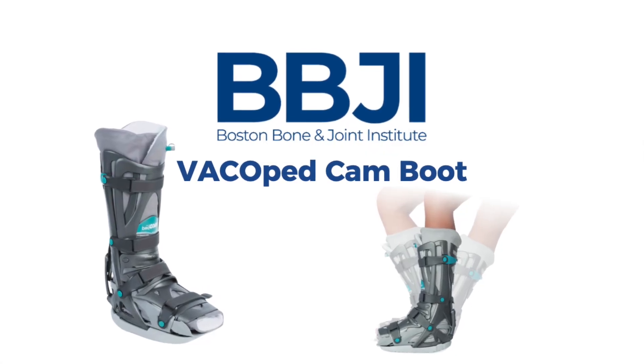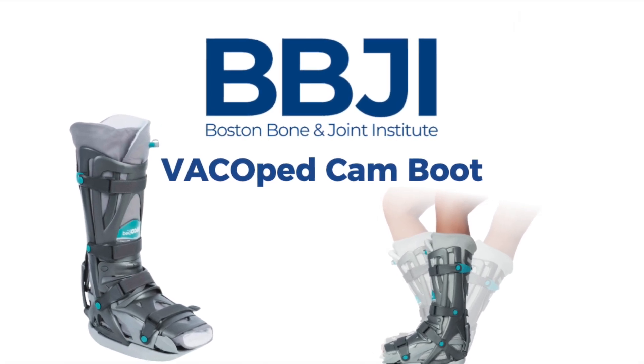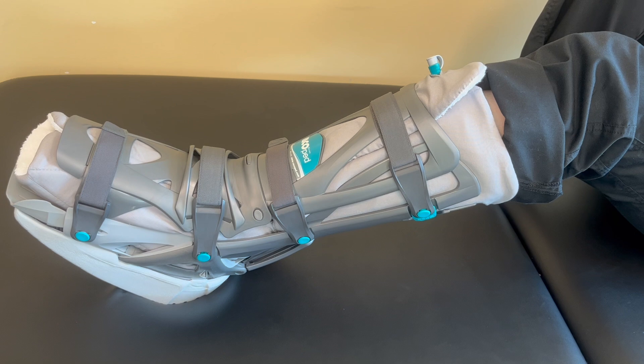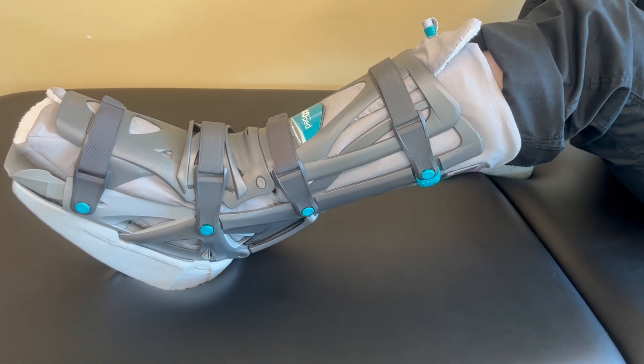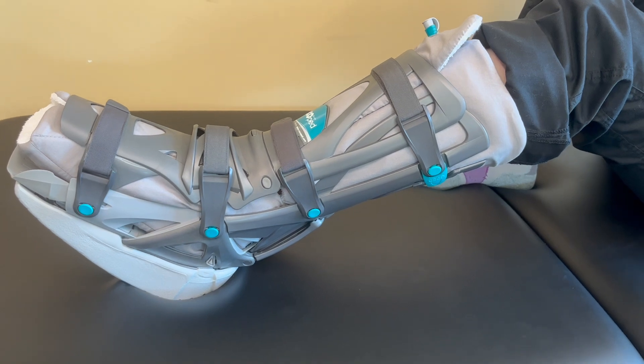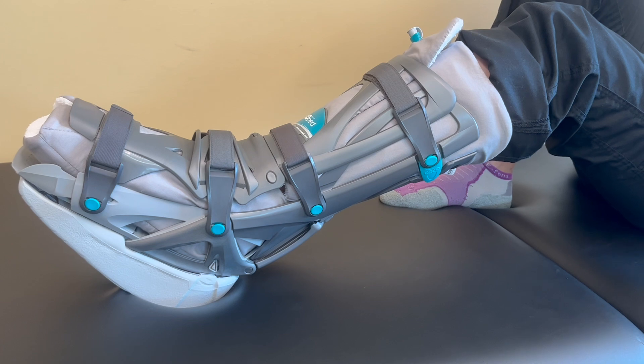Hello, welcome to Boston Bone and Joint Institute. If you're watching this video, you may have a few questions about your Vacoped boot. This is the Vacoped Cam Boot by Oped. This boot has the ability to lock at various degrees of range of motion and features a vacuum liner, which together immobilizes your foot and ankle.